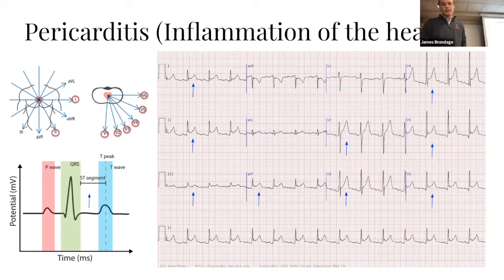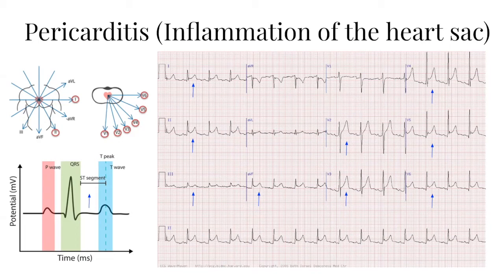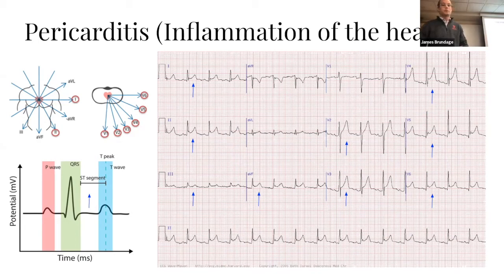Yeah, exactly. And it's important to recognize that this is one snapshot of one patient with all these different leads. But also throughout time, let's say a patient is in the hospital for a heart condition. Well, we might take an ECG every day, and there may be an evolution of how that's presenting over time.